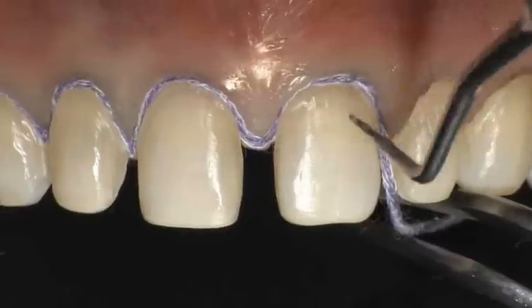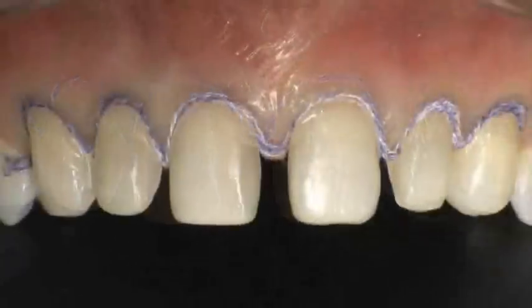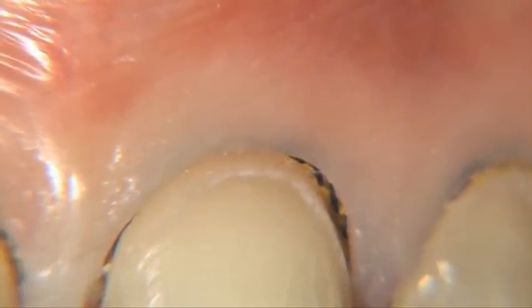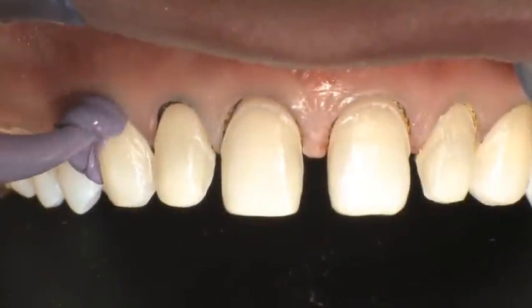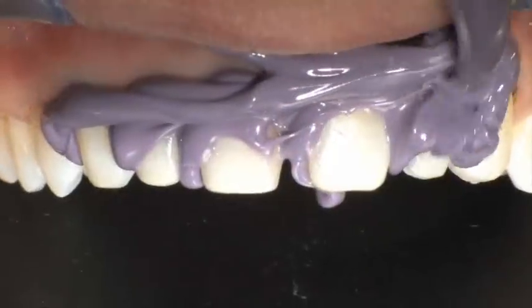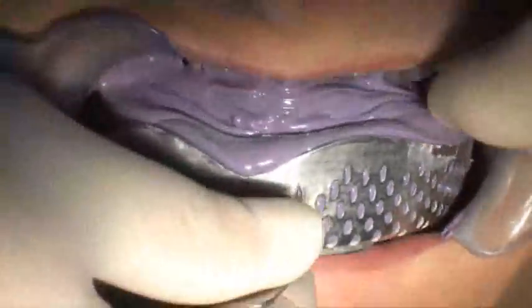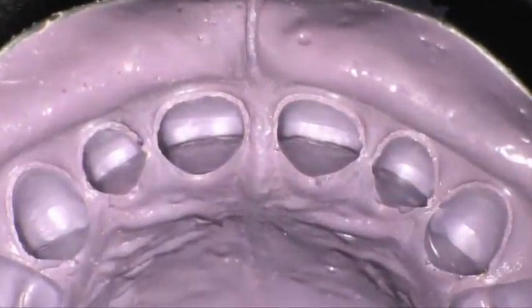In this phase, it is really important to avoid traumatizing the soft tissue during the cord positioning. After the second cord removal, an impression in polyvinyl siloxane was taken. It is important to visualize the impression to understand if the technician will be able to read clearly the finish line and the details of our preparation.